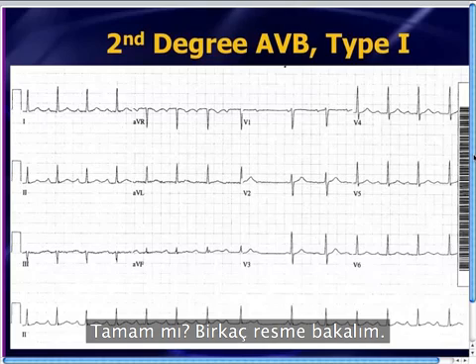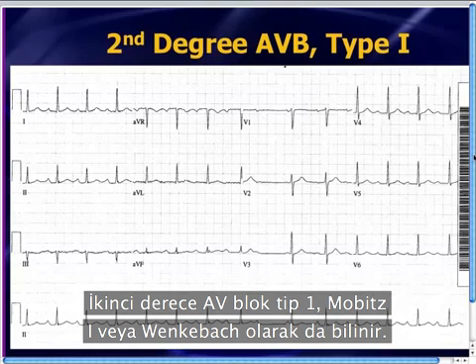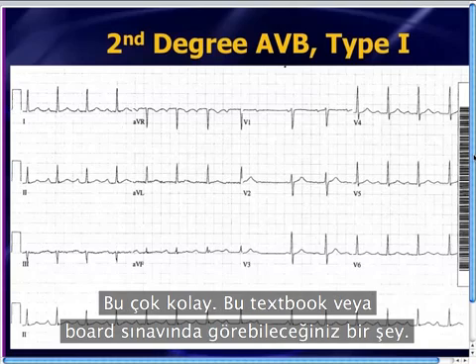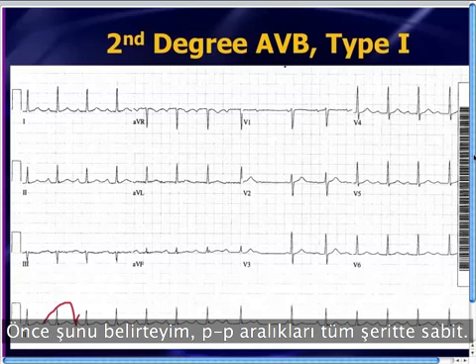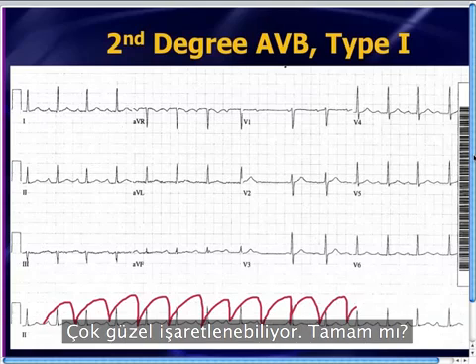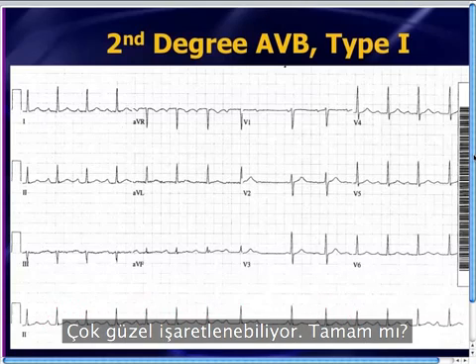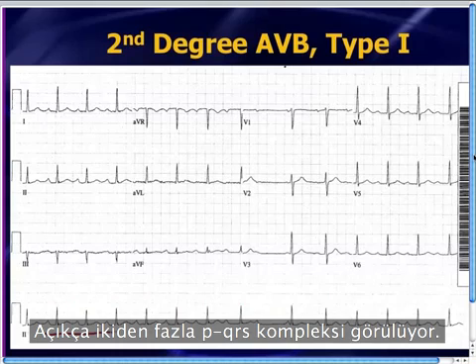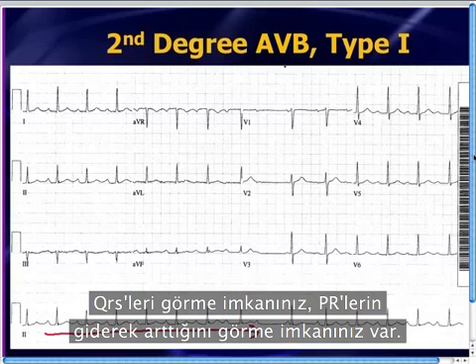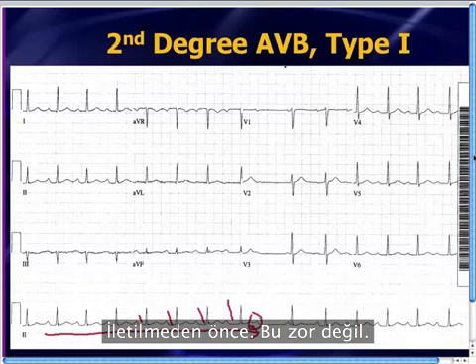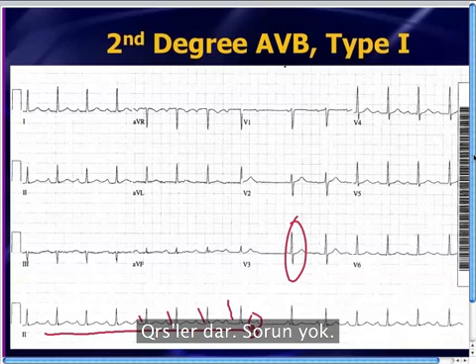Let's look at some images. Here's second-degree AV block type 1, also known as Mobitz 1, also known as Wenckebach. This is a piece of cake — the kind of thing you'd see in a textbook or on the boards. Note the P-to-P interval is constant all the way across; if you use calipers and map this out, it maps out very nicely. There's clearly more than two PQRS complexes where you have an opportunity to see that the PR intervals are gradually increasing before the drop. QRS complexes are narrow.